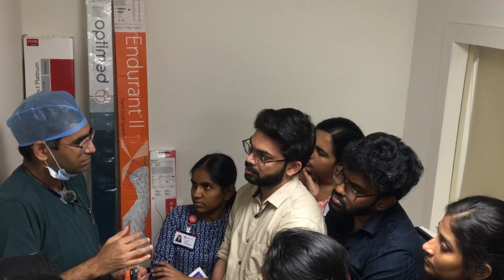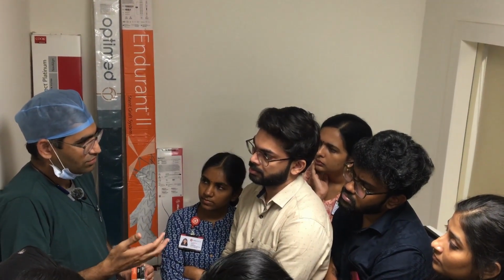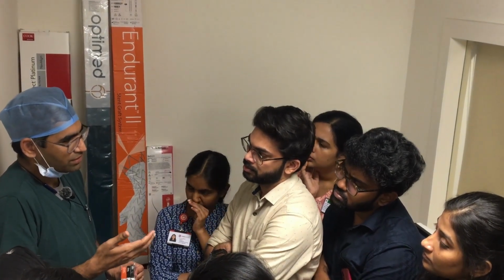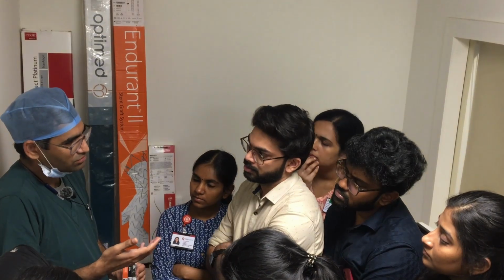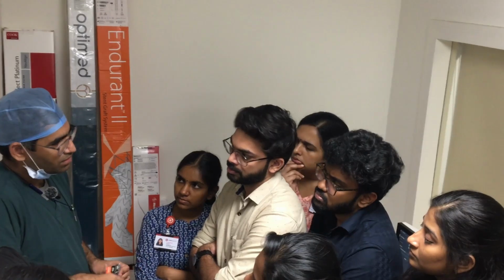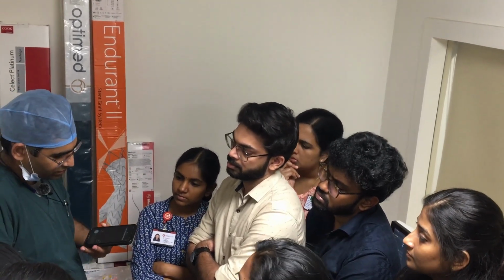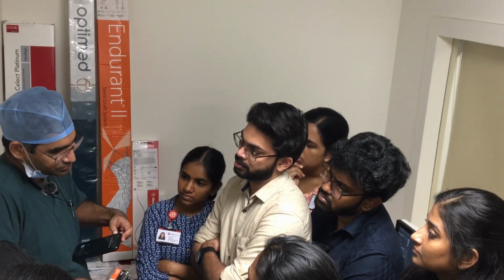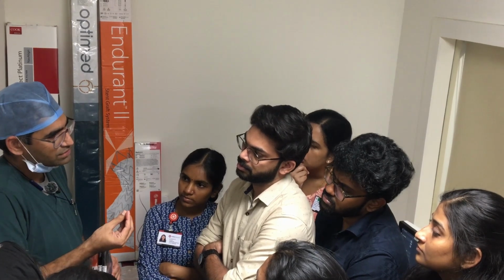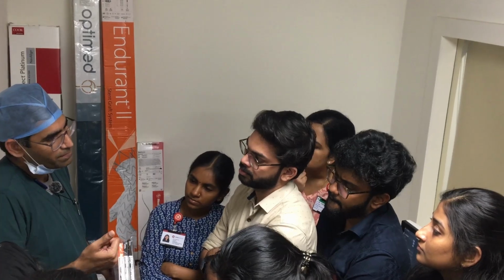The basics of angioplasty: the first step is access. You have to have access to the vessel, and you have to have a stable access. That's where we use bigger sheaths, and that's where biaxial and triaxial systems work. So you have a sheath inside, you take a catheter, and then inside you take another microcatheter, and then you go with the wire. It gives very good stability if you have a triaxial system, especially when we are doing hard lesions. We discussed CTO: the more axial, the better support it will give.